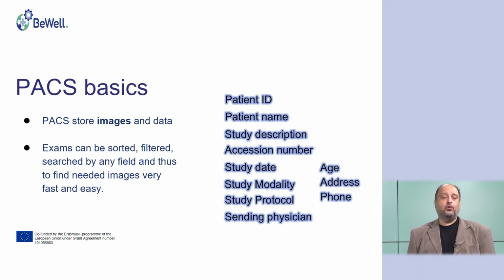Exams can be sorted, filtered, searched by any of the general fields, for example, by patient name or by referring physician, and so on. And this allows images to be found very fast and very easy.